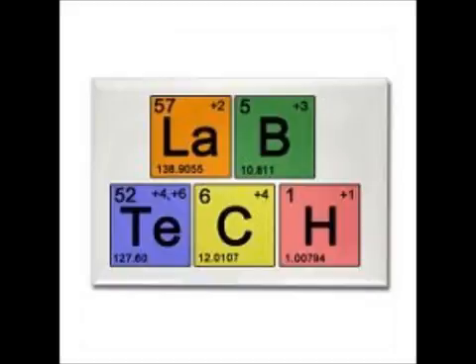If that's what it normally does, if all of us are normal and it does this, I don't even have you know it because I don't see the point. It doesn't really show any true release reaction and aggregation. So you don't have to know serotonin. And the only ADP I have you know is the one that shows the biphasic. So optimal ADP, you see the release reaction in the second wave, and it gets to about 65 to 70%.